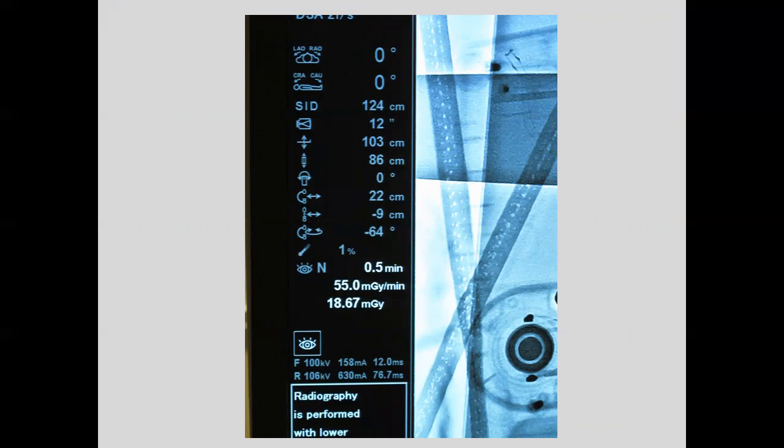The other thing that we've added new to the VA is anytime our cumulative air kerma gets above 3 gray or 3,000 milligray, we're supposed to tell the doctor that we've hit that threshold. And then every 1,000 after that, we're supposed to also say something to the doctor. Newer machines are coming out with automatic alarms for those. You can set those levels. So you have the 5-minute timer going, plus you have a cumulative air kerma timer going. So that's going to be fun when we get to new machines.